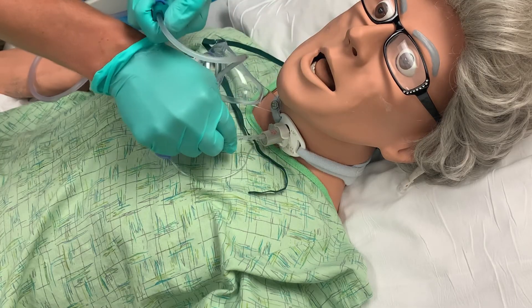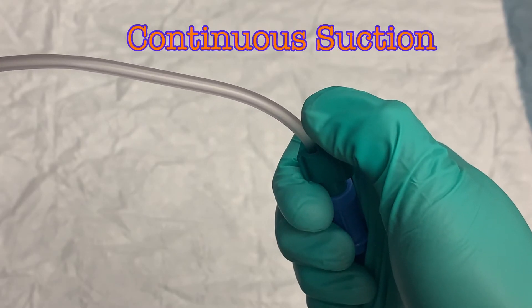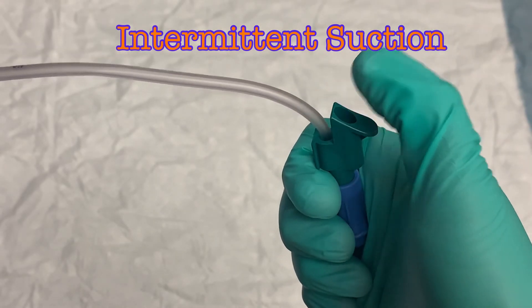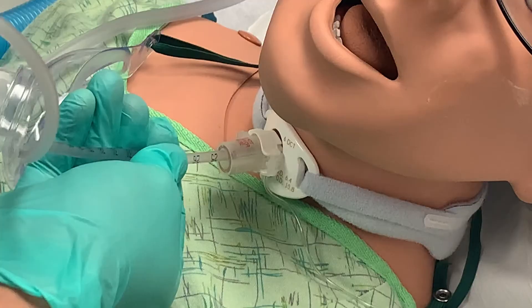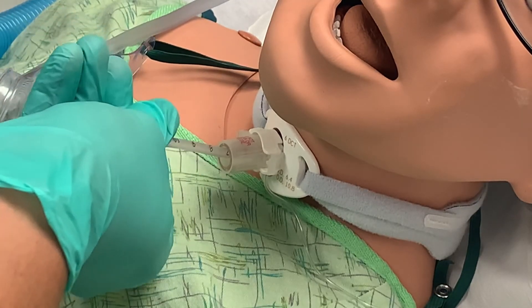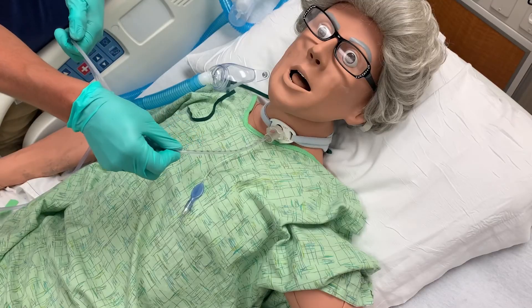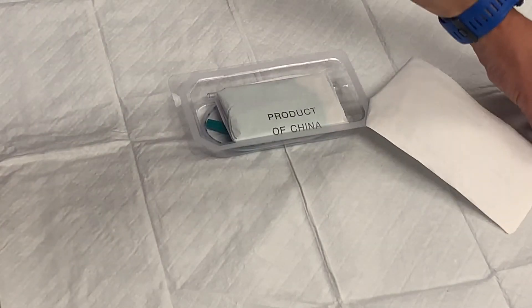Now begin suctioning by covering the port on the green adapter with your thumb. You can apply continuous suction while removing the catheter by holding your thumb over the port during the entire suction attempt, or intermittent suctioning by lifting and replacing your thumb while you retract. Neither method has proven to present any additional risk of trauma to the patient. While suctioning, slowly pull the catheter out, rolling it between your fingers with your dominant hand to more evenly apply suction. Keep your dominant hand close to the trach as you remove the catheter — if you hold further back, the catheter tip will likely drop and contact the patient, contaminating it, and you will need a new catheter for any additional suction attempts.